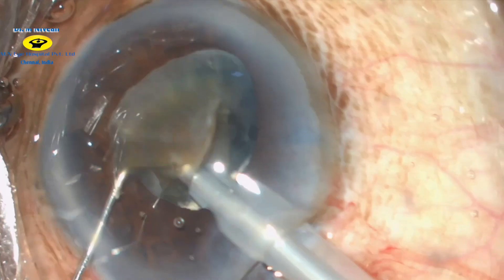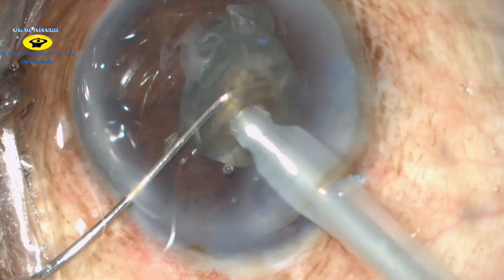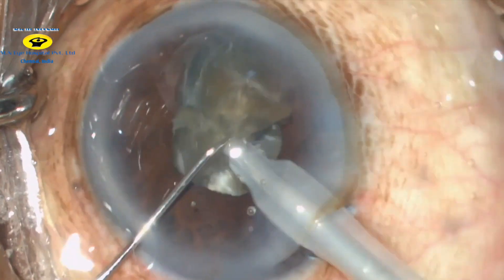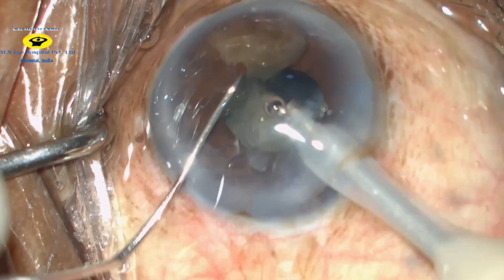The free nuclear fragment is brought to the pupillary plane and emulsified. The nucleus segment is then broken down into smaller fragments, and these smaller fragments are then emulsified.